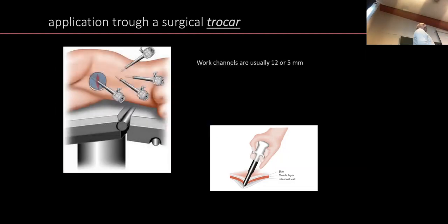During surgery, that can look like this. If you ever have minimally invasive surgery, laparoscopy with cameras or the robot, they basically use trocars like this to bring in the robot or whatever, the camera and all the tools that are needed for surgery. And 3 or 4 ports are usually sufficient for the whole thing.